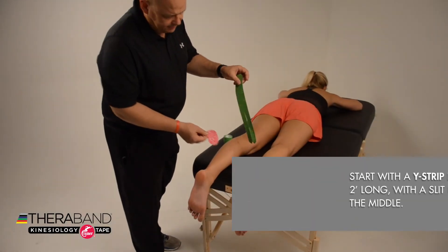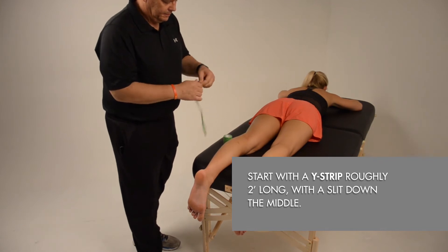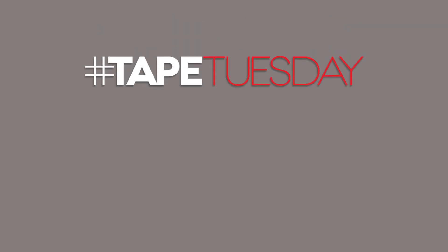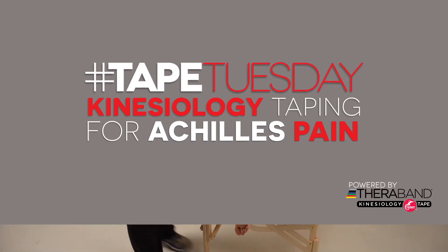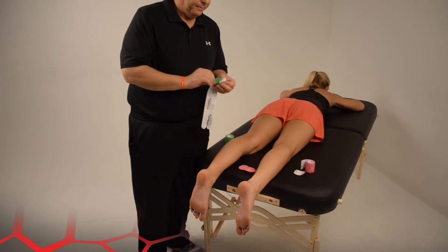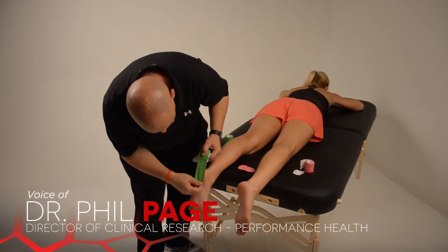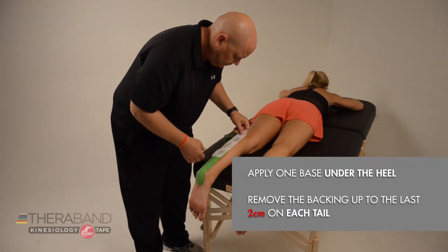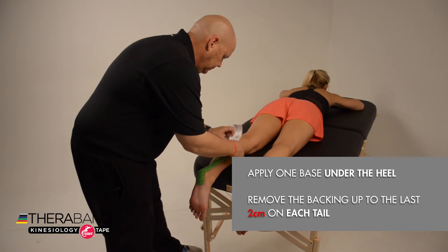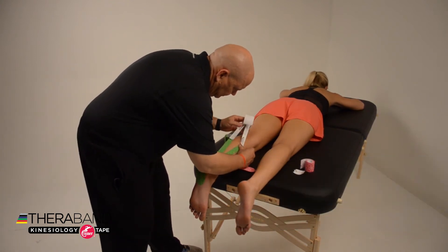For our Achilles tendon tape job, we're going to start with a Y-strip about two feet long that's slit down the middle — the length depends on the size of the patient. We're going to apply the one base at the heel, right underneath the heel a couple of centimeters, then remove the tape backing up to the last couple of centimeters on each end of each tail.